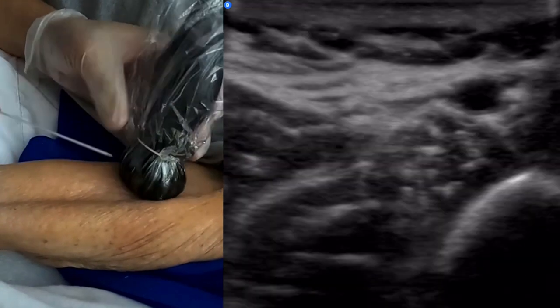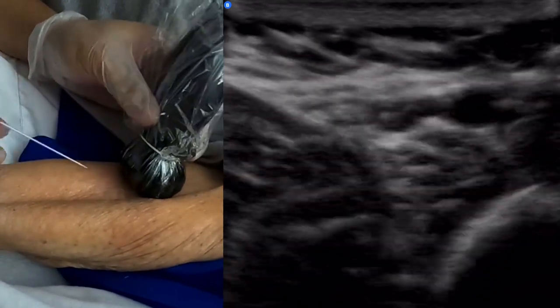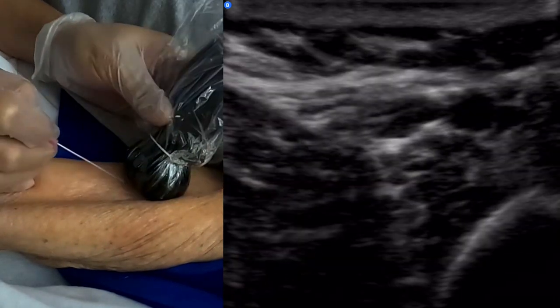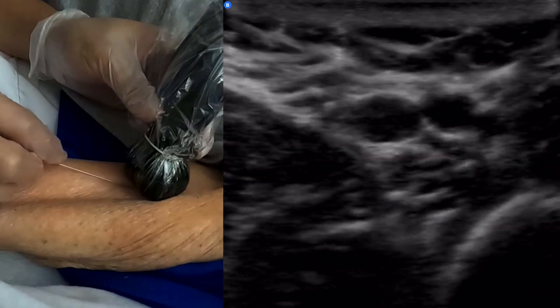Okay, here we go. Are you ready for a quick big stick? All right, gonna put a needle, okay? But I need you to not move, all right? Here we go, 3, 2, 1, stick. Let's see where we're at, there we go.